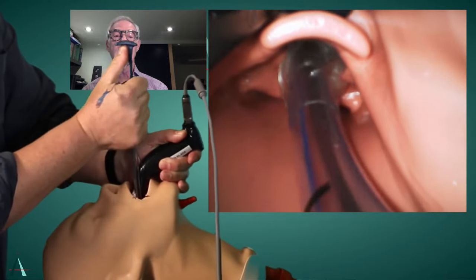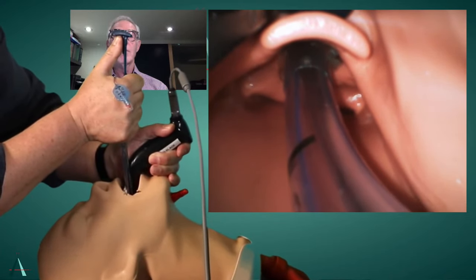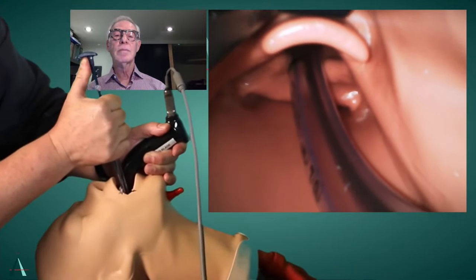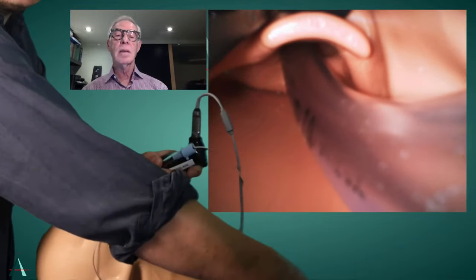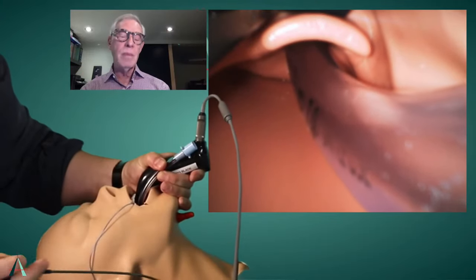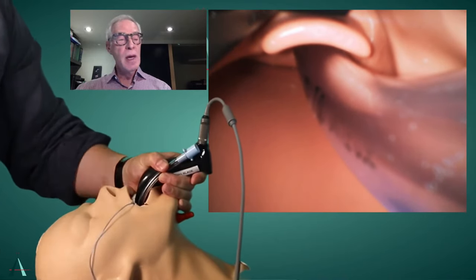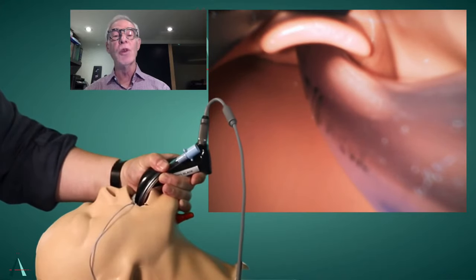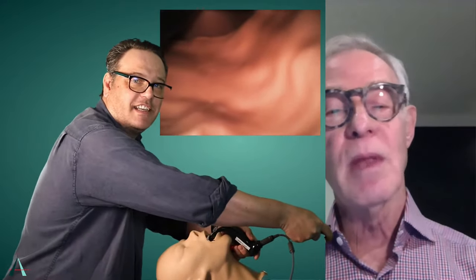I do a bit of a shuffle here where I like to pull that back, and you can see, I can just see the tip of that ball on the tip of the stylet there, and then advance that forward. And then I grab that there and pull it out. And the pulling out's quite important too, isn't it, Richard? The movement for taking the stylet out. If you're using the rigid GlideRite stylet, it's important to realize that what you're doing is a kind of reverse rotation, pulling it out toward the feet, not pulling it straight back. So it's coming out like this, yes? That's right.